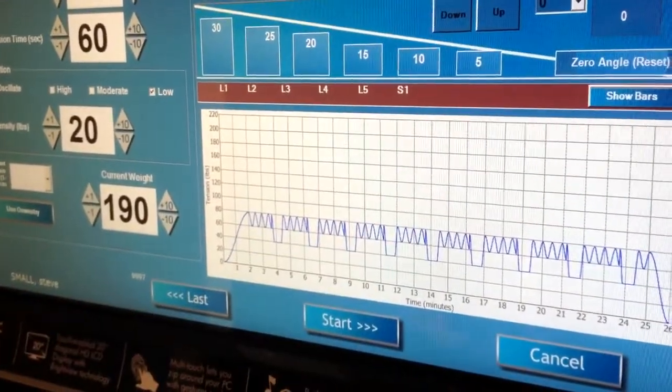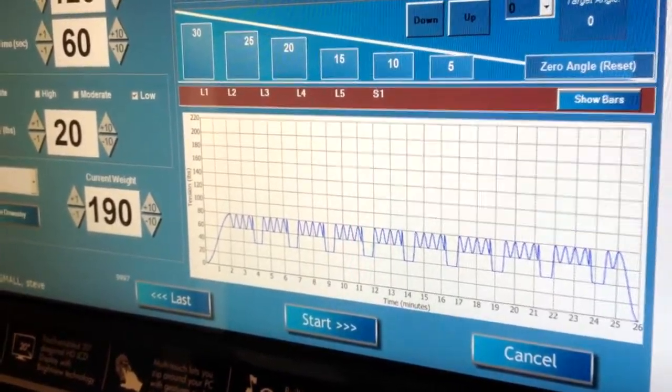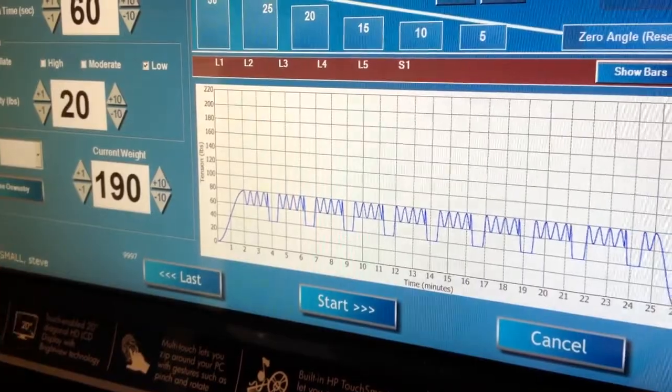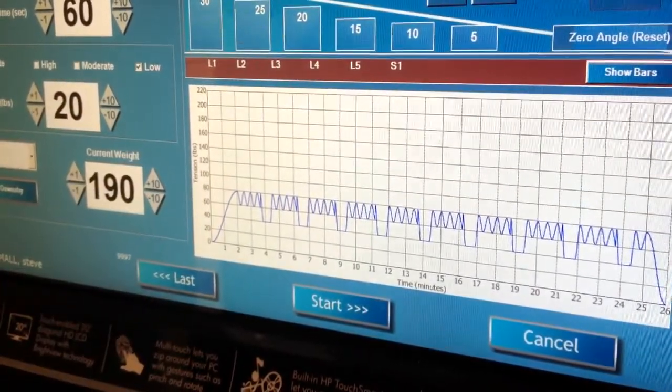So that's what it looks like on the screen. Now I don't know whether anybody has actually felt this on a treatment because patients typically have a standard treatment.